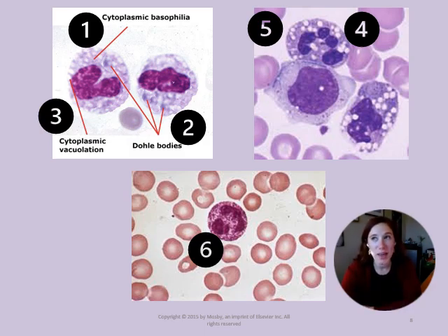Now, what is another way that our cells could be altered due to us? Well, maybe we didn't stain it properly. Maybe we left our slide in the last purple stain for too long and we got distracted, or you had a seizure patient walk in, or we had to run up front for something in the hospital, and you left that in there, and then you're like, oops, left that in too long. Could we see stain issues, or it's going to be darker than it should be? Yes. So what should you do? Well, I hope you said you make another one, but if your patient's clinical and having issues, you should make another one.